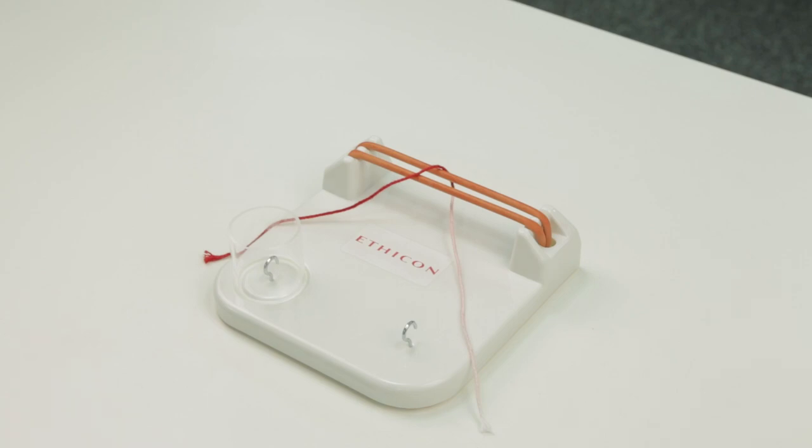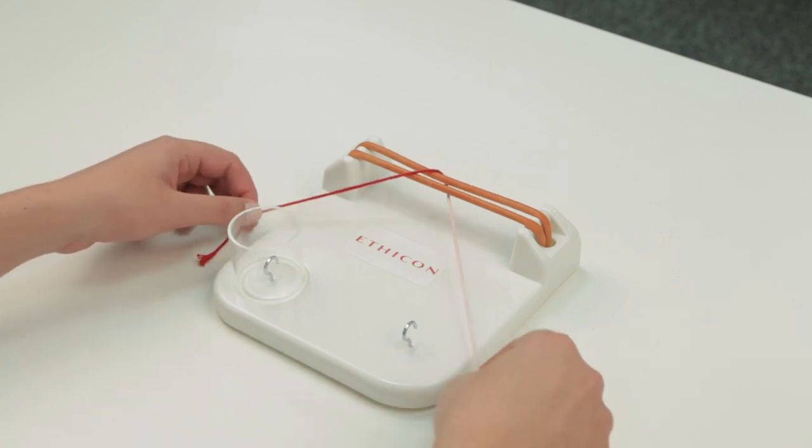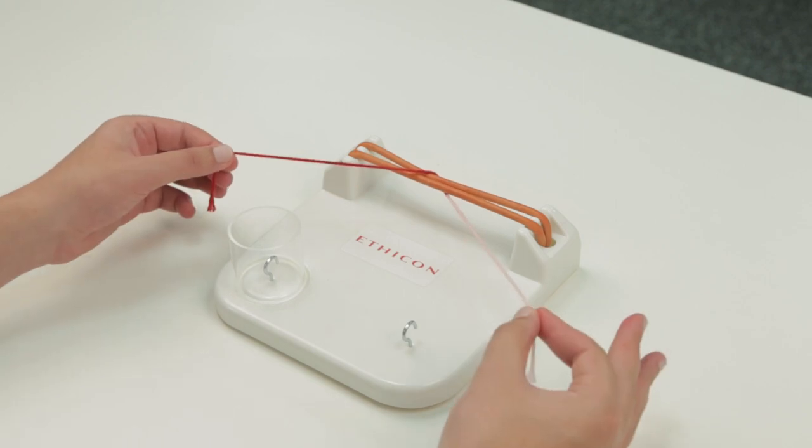Take the suture end that you will be tying with in your non-dominant hand and hold it between your index finger and thumb.